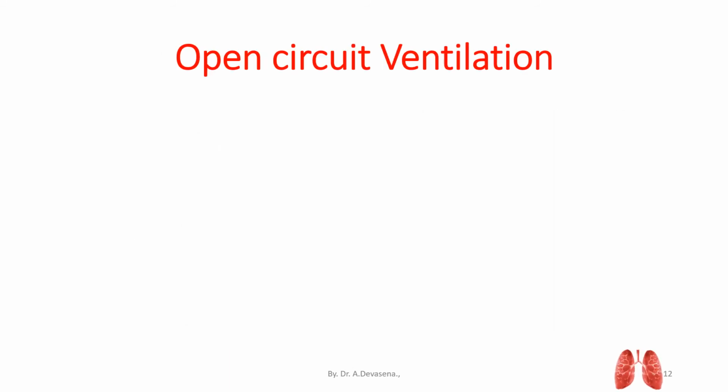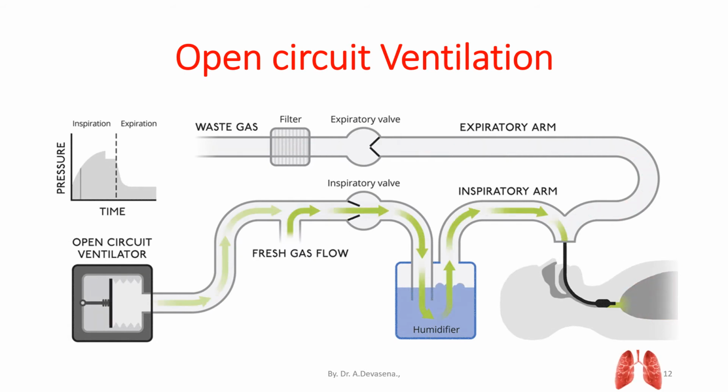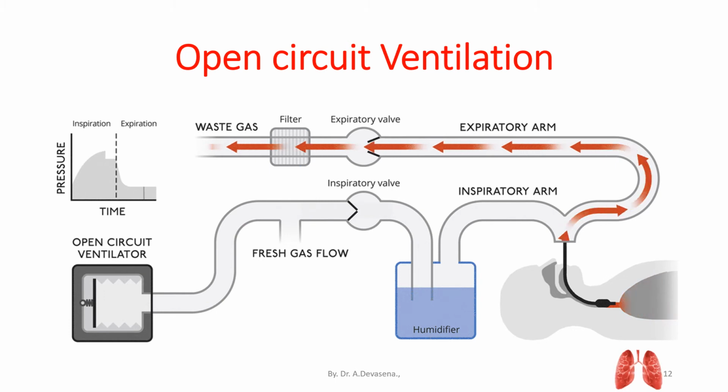Open circuit ventilation representation is shown here. In this circuit, from the open circuit ventilator, fresh gas flows into the humidifier through the inspiratory valve.